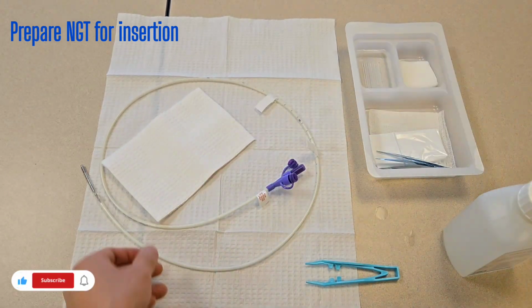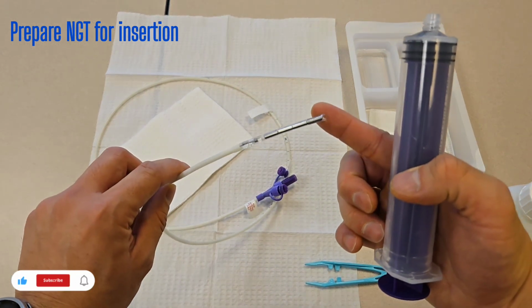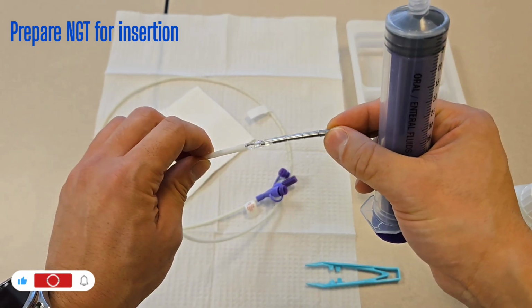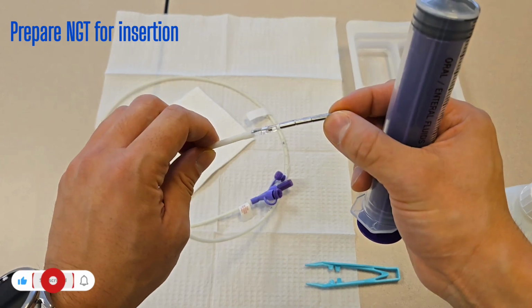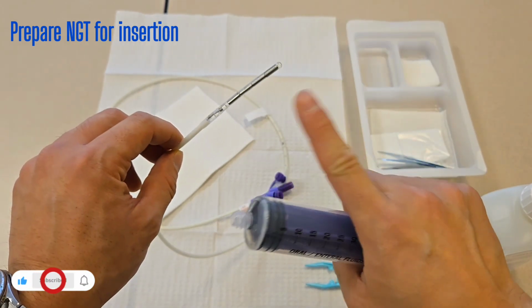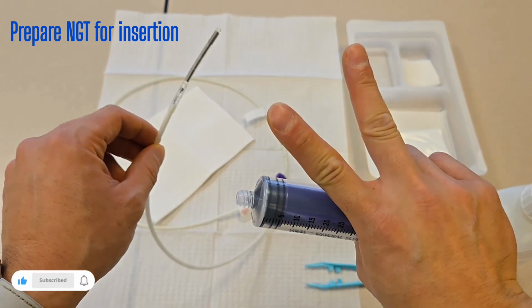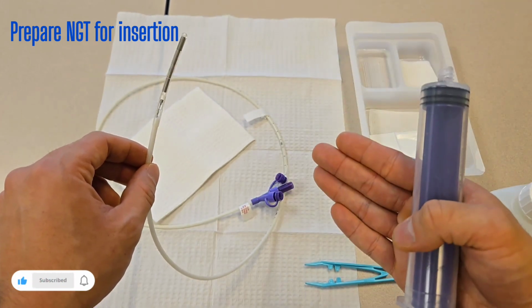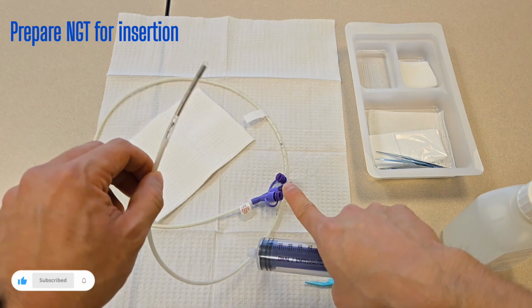First and foremost, this NG, because it has a metal guide wire, this one you do not need to put lube or lubricant into it, because this piece of plastic over here, when it touches lubricant, it can get very, very sticky. Instead, you're going to flush the tube twice. The first time is going to be to lubricate the tip so that it goes in easily. The second time that you're going to irrigate is after the tube has been confirmed by X-ray in placement to remove the metal guide wire, and we will revisit this step.